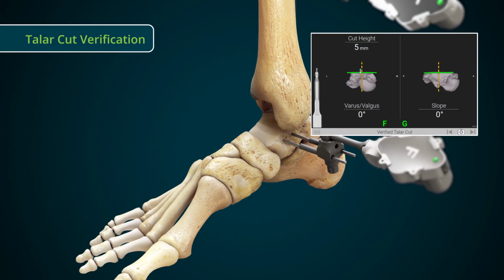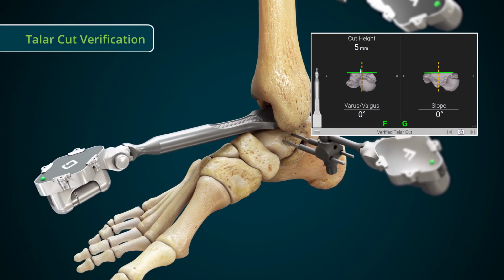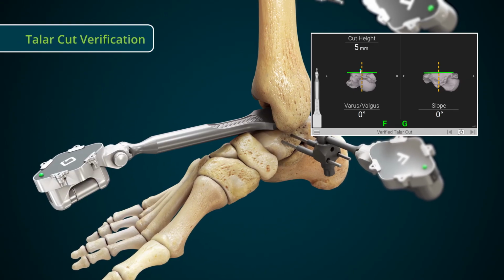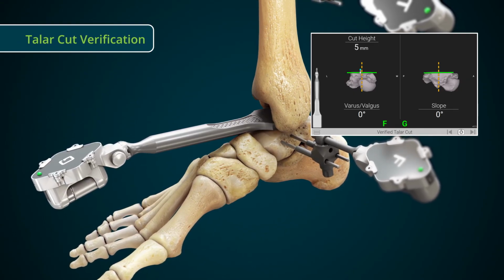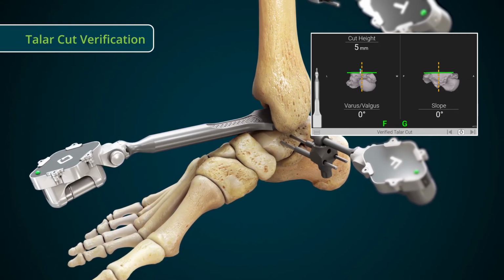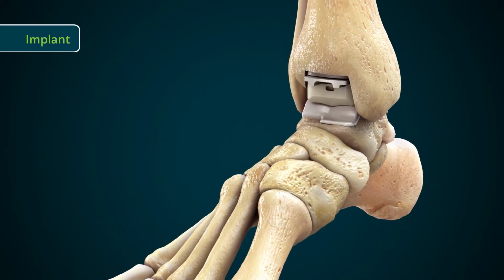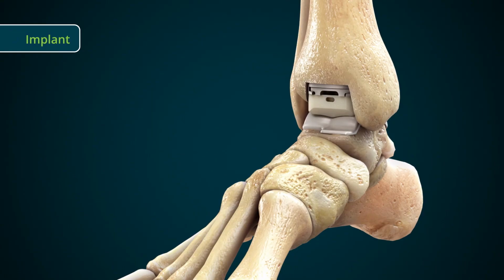Connect the G-tracker to the cut checker. On the screen, a white line will show the cut's true location. Once the performed cut and the planned cut are aligned, the cut's location line will turn green. Implant the vantage ankle implant per the specified technique.